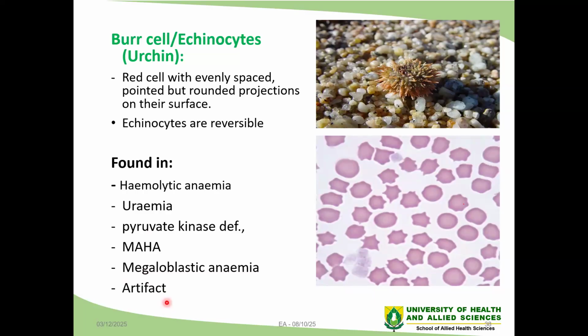So you need to be able to examine the film carefully and ask yourself questions that will help you rule out that what you are seeing is not real, and that there are just artifacts being formed as a result of maybe poor storage.